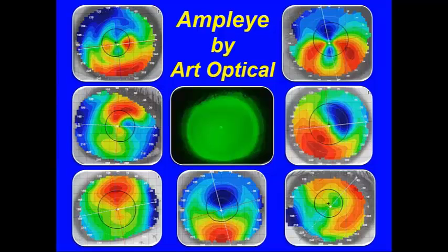Okay, here's one about topographers. There are many topographers on the market. Is there one out there that you recommend as a better unit for fitting these types of contacts? Well, all I can say is that we've evaluated quite a few at the university, and the one we settled upon is the one you're looking at right now, and that of course is the Medmont corneal topographer.